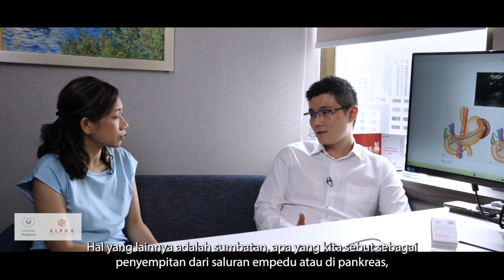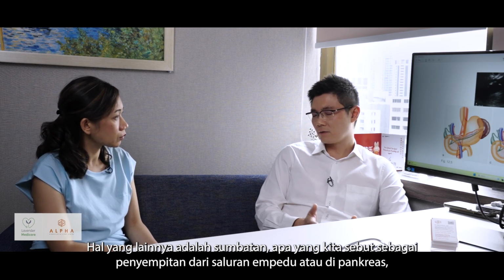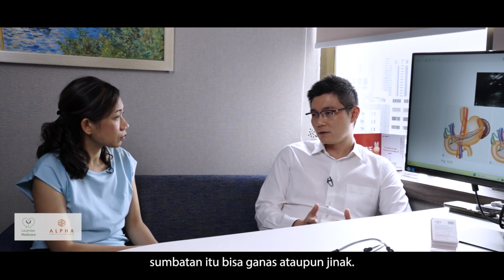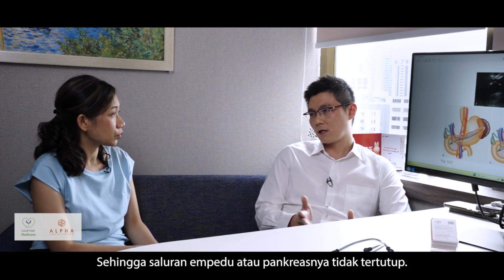So the second thing would be blockages, what we call strictures in the bile duct or the pancreas. And then they can be malignant or benign. And again, instruments can be passed through to either diagnose the nature of the stricture and to stent the stricture so that the bile duct or the pancreas duct is not blocked.